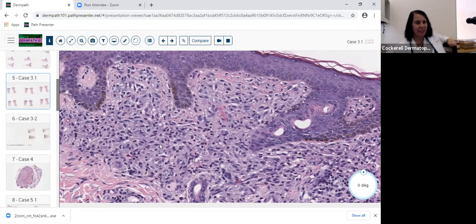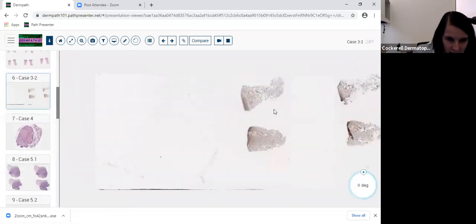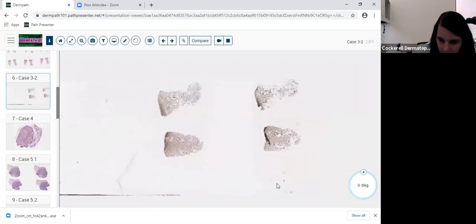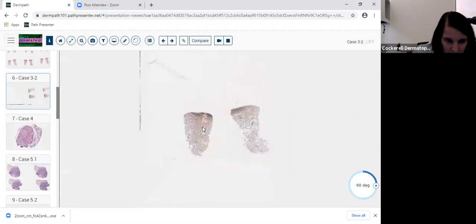Now the question is, is it a mastocytoma, or is it TMEP? No, TMEP is usually just superficial perivascular with mast cells scattered around. Or is it urticaria pigmentosa? So now I'm going to get my stain to confirm that these are tryptase positive. And we have that here. We have positivity, and you can see the brown stain even from here.